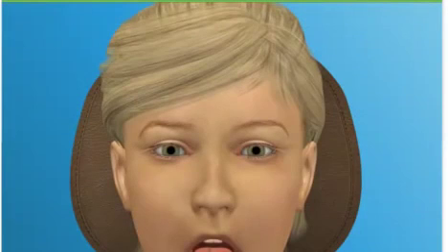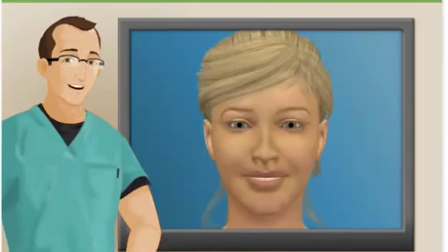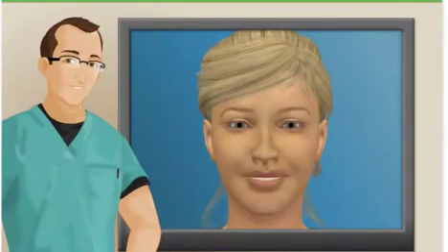At this point, the dentist checks the patient's bite to ensure that everything is normal and the patient doesn't experience any discomfort. Fortunately for our patient, you did an amazing job, and there doesn't appear to be any issues with the filling or our patient's bite. All done. It looks perfect. After the procedure, our patient may experience some sensitivity, but it should subside within 1 to 2 weeks. If it doesn't, they'll need to contact their local dentist office.